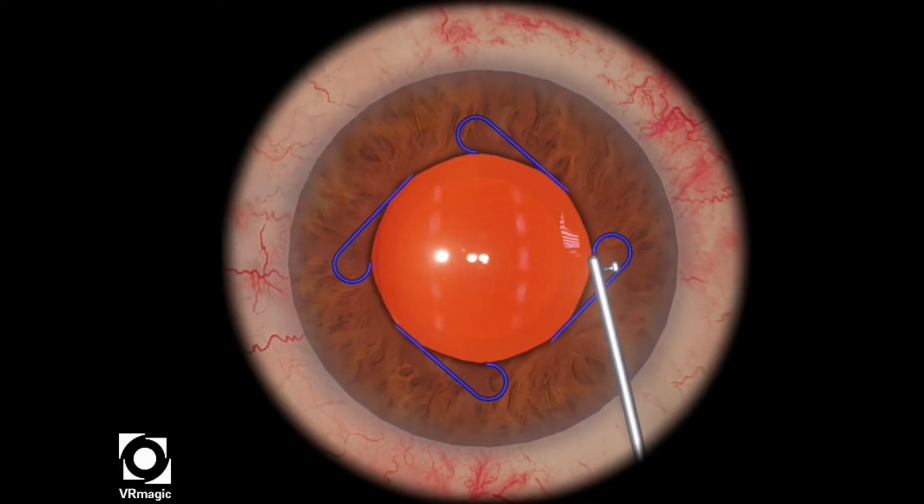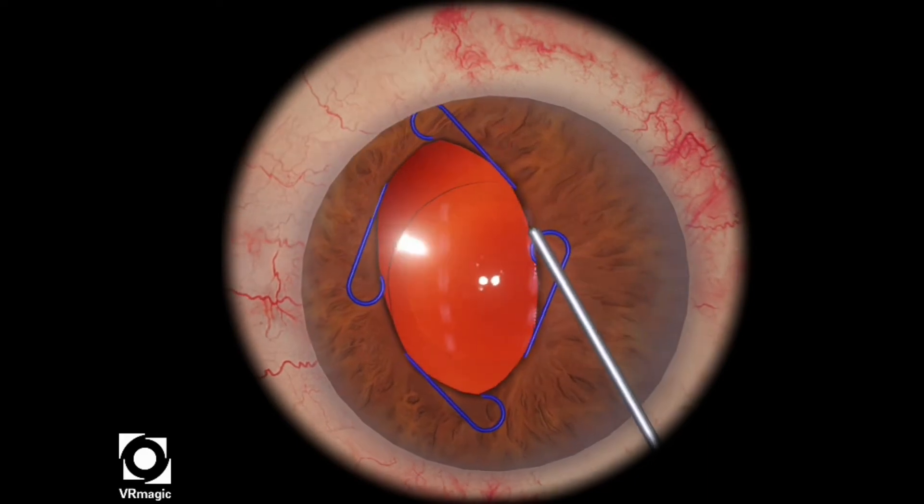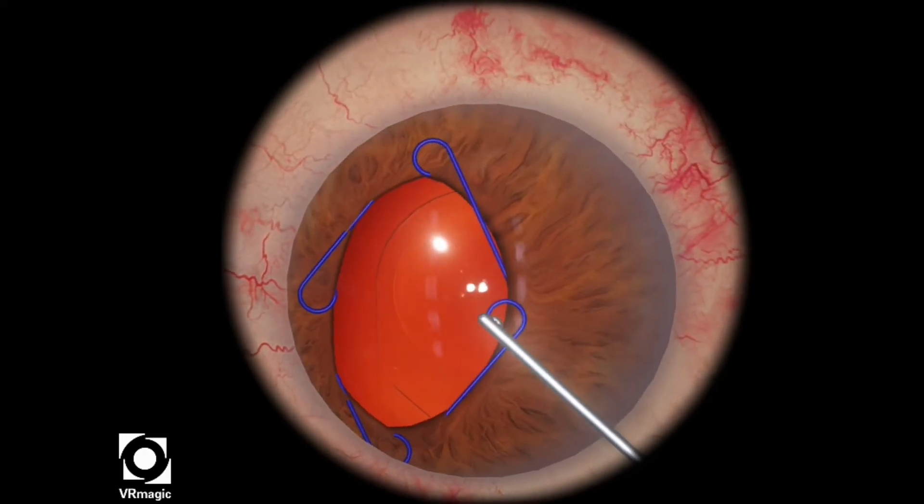In this particular level, your job is to remove the iris expansion ring, or the Malyugin ring. You can see that there is already an eye well in place.